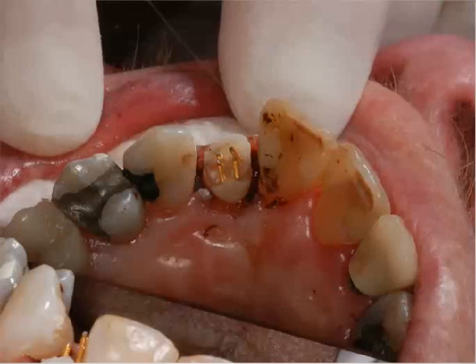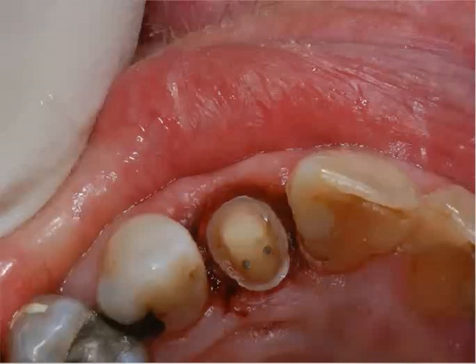As we look down this, you can see the tooth was vital. I put in some pins, some Coltine pins. We're going to do a build up. They normally do an endo, but patient didn't want to go through the time and expense, and to use this was really a time saving for her. But anytime you use that electrosurge, there's usually increased bleeding and potential for increased recession down the road.